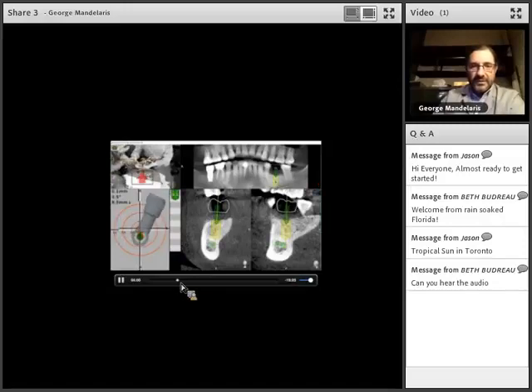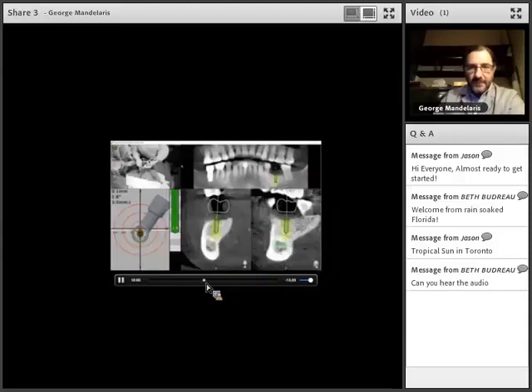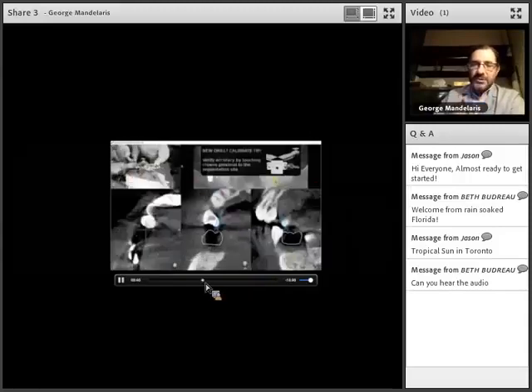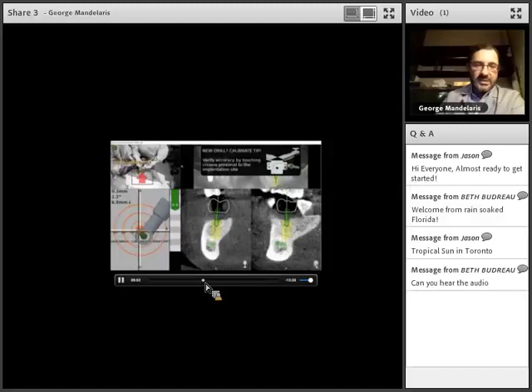So I'm going to move this forward a little bit because you don't need to see osteotomy site preparation. You guys are all master trainers or experts in your own right. So I'll just move this forward. But again, at each step, when she's changing the drill tip, it's another accuracy check to make sure that we move forward. So once that accuracy check with the 3 millimeter drill has been accomplished, now we start the osteotomy site preparation.